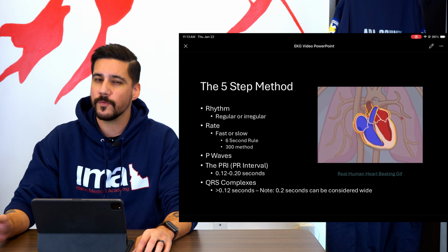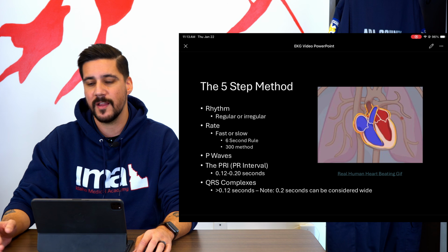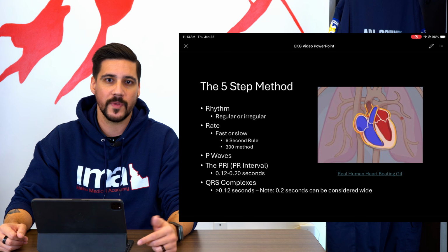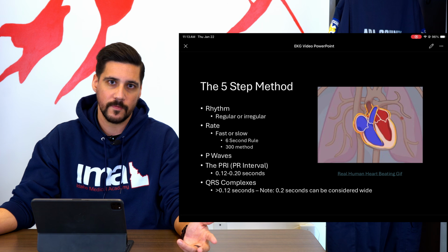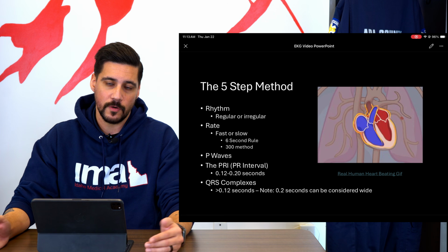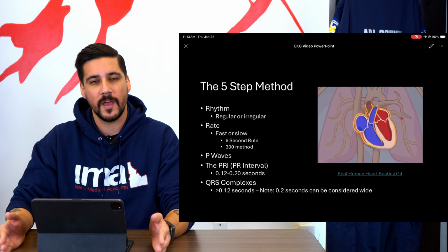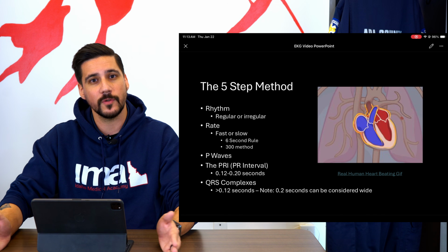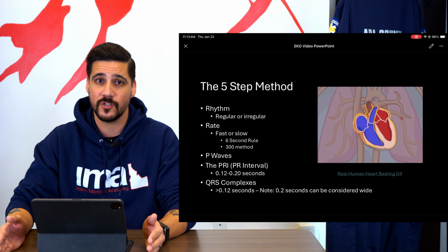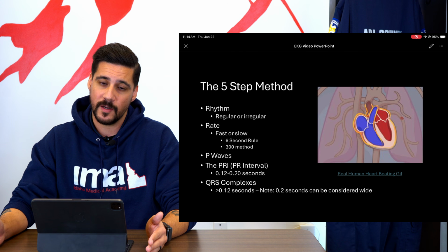Same thing kind of goes for our tachycardia. If someone's at 110, maybe even 120, but they just got done exercising, they did something stringent, maybe it's me sitting up off the couch, right? I'm going to hit 120 every time. Just things to consider, right? Not every time it goes past those normal boundaries is going to be problematic, but it is something that we need to at least pay attention to so we can identify, okay?